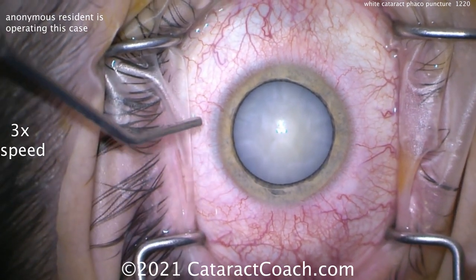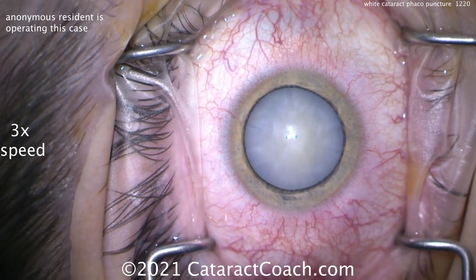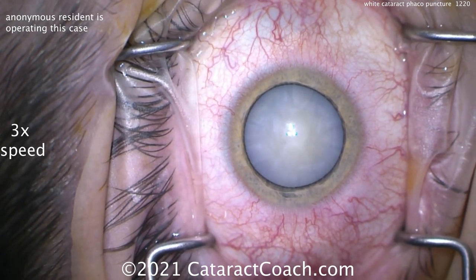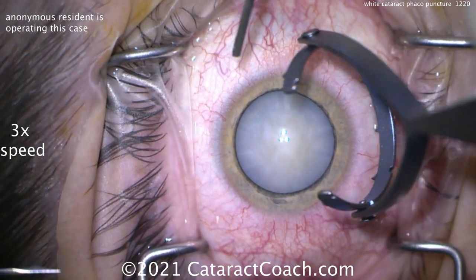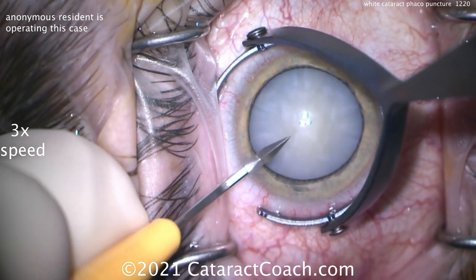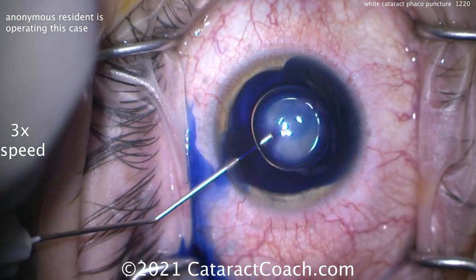We're going to speed the whole video up to about three times the normal speed so I can show you the whole video. This is an intumescent cataract, so it's fluid filled. If you look at it, it's not so yellowish or brownish — it actually has a slight milky white or bluish tint even in the periphery. In the center of the nucleus, there's some degree of nuclear sclerosis, that's why it's slightly yellow in the center. But look at the periphery.